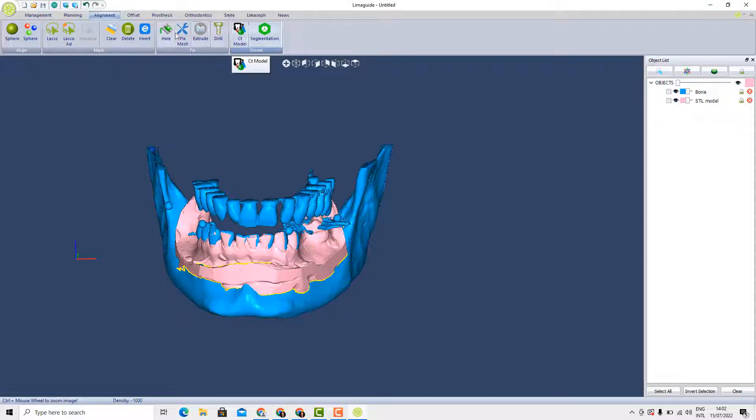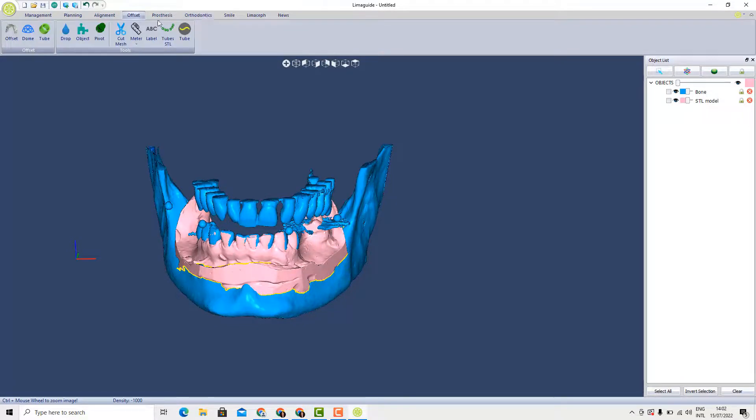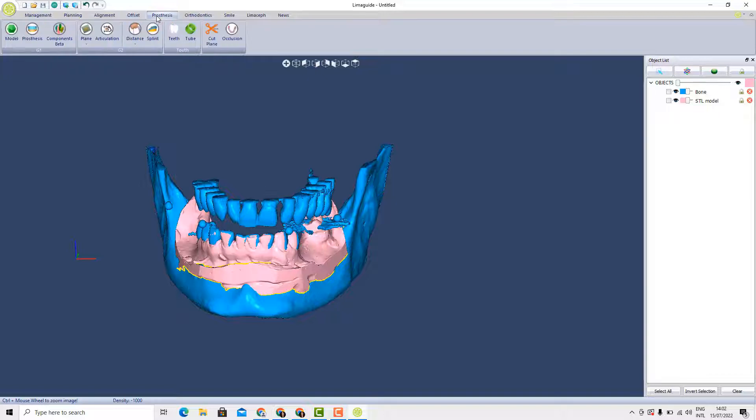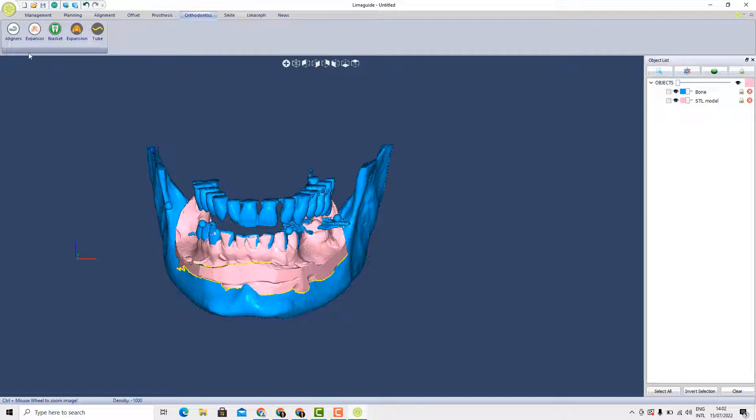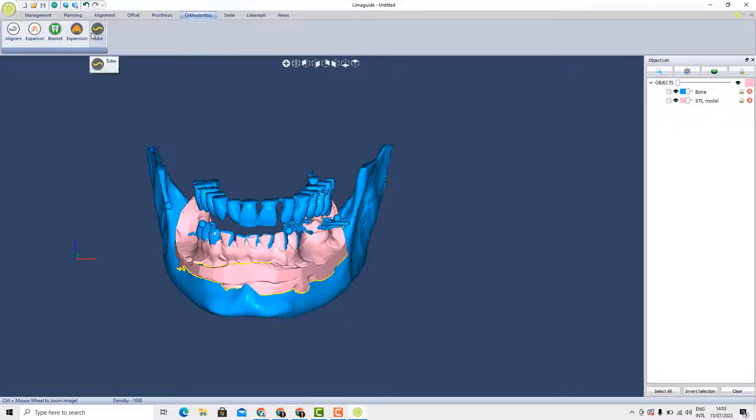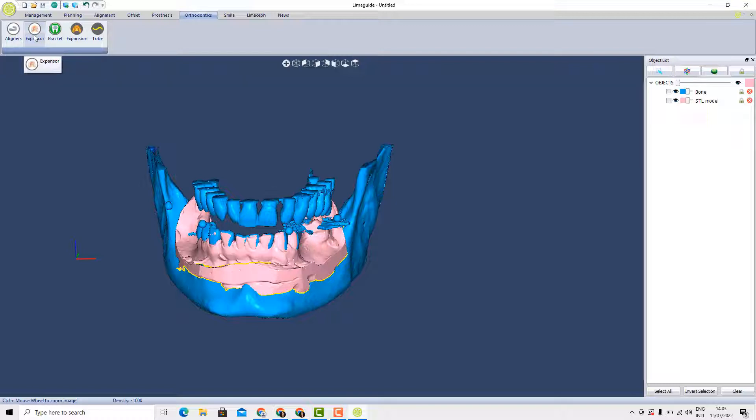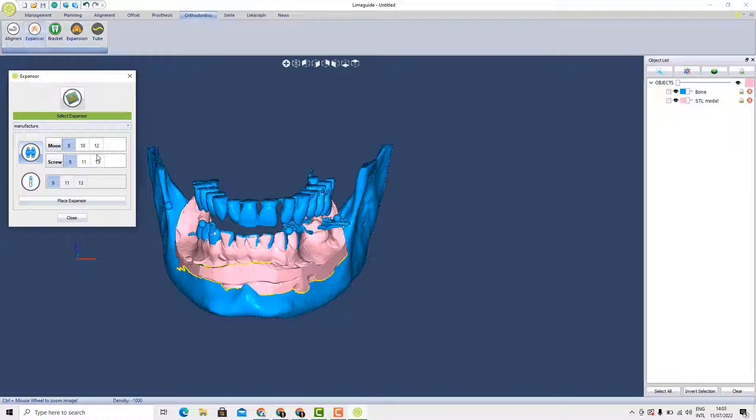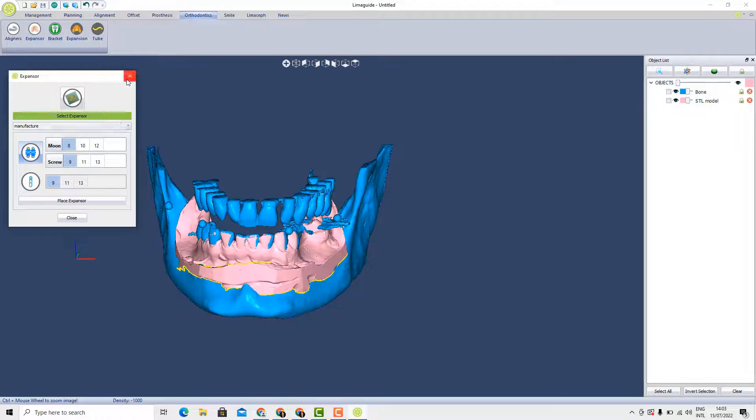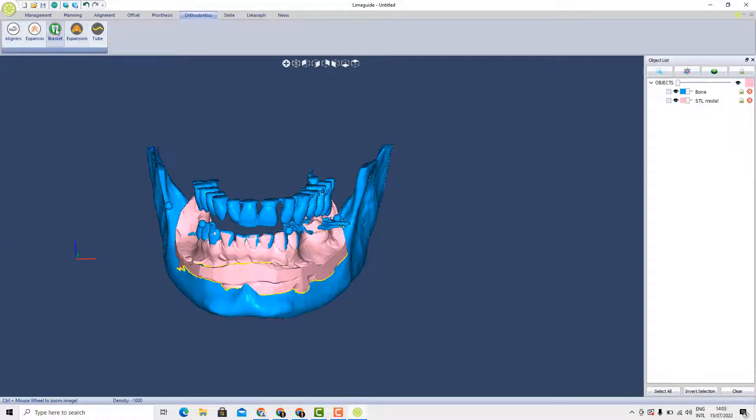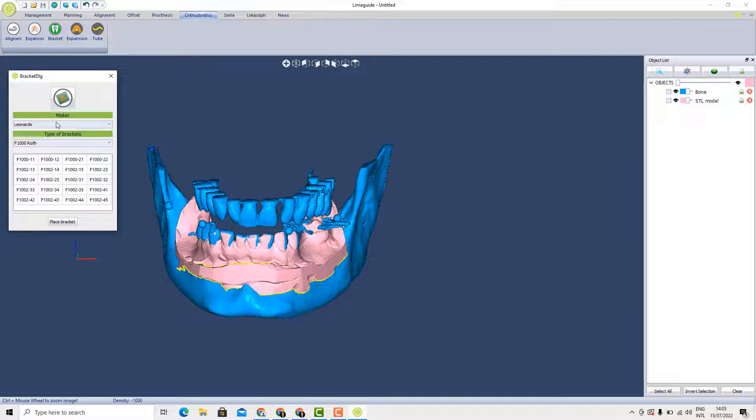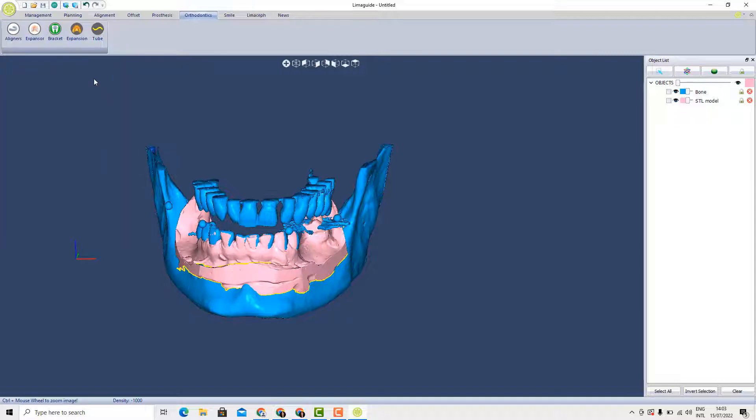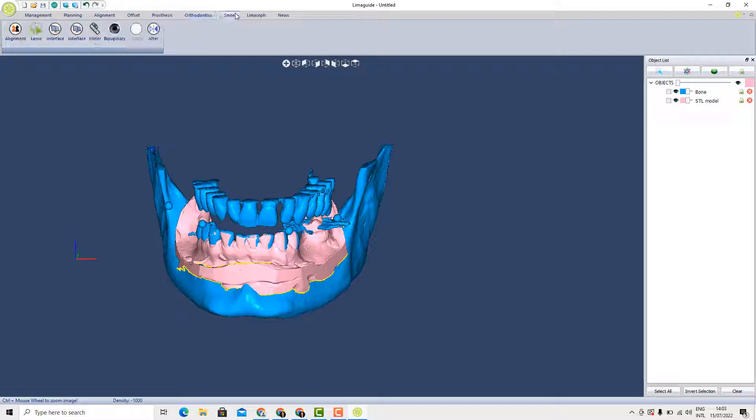For example, here we have the offset section, the prosthesis section. We have also the articulator function, orthodontics. All these tools can be worked on except aligners is not active yet. The brackets, we have the brackets, we have the Leonardo option, present for now, etc., and to create a digital smile design.